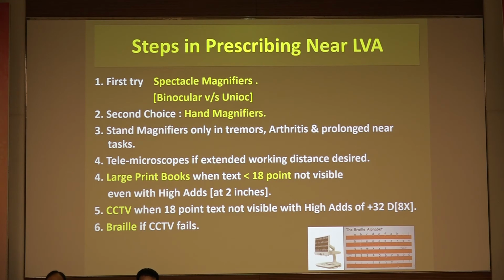A stand magnifier is given only in those patients who've got a tremor or arthritis and prolonged near tasks have to be done. Tele microscopes, which Vivek did not discuss and which are very expensive, normally we don't give in our practice, are for those patients who require a large working distance for near.